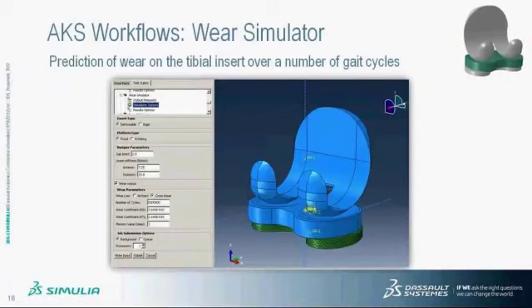The fourth workflow is the wear simulator. It is used to predict wear on the tibial insert over a number of gait cycles. We provide equivalent parameters as in the actual physical wear tester that include the gap distance and the linear stiffness.